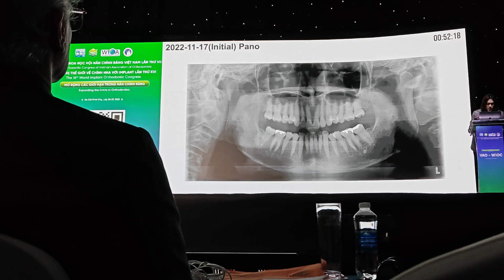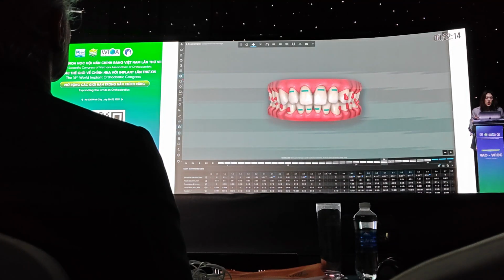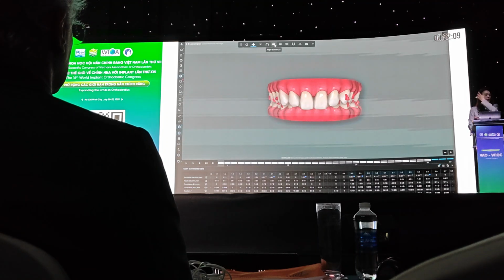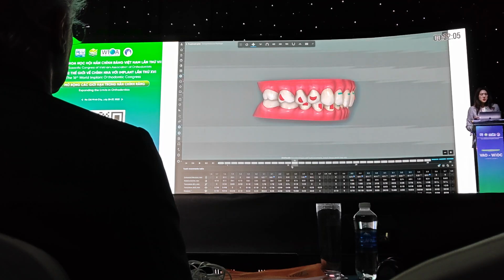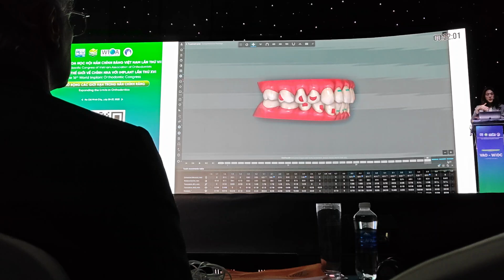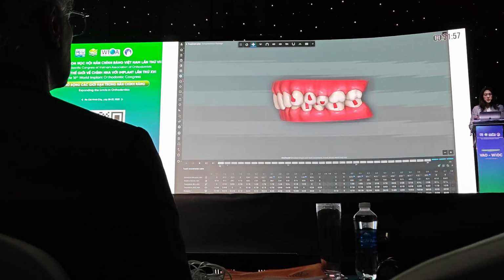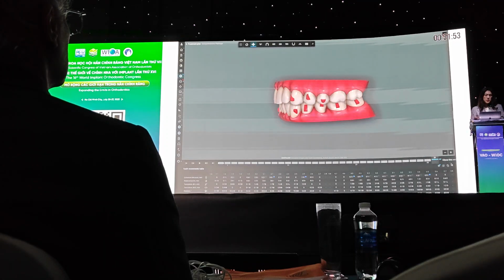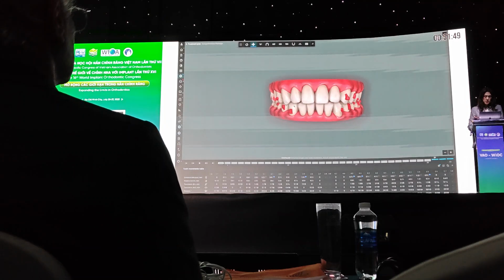extruded upper and lower incisors. This is a ClinCheck. Even if they have the G8 protocol to intrude the lower incisors more effectively, you also have to over-engineer. So I try to do the ClinCheck to make the patient almost edge to edge, almost like open bite. You definitely have to do this because otherwise you're not going to be able to correct the deep bite. So this is a ClinCheck.